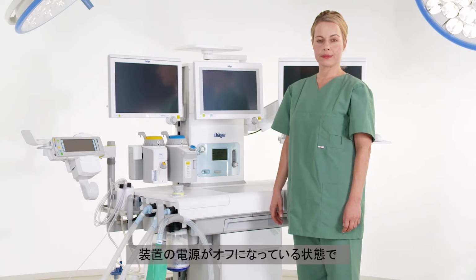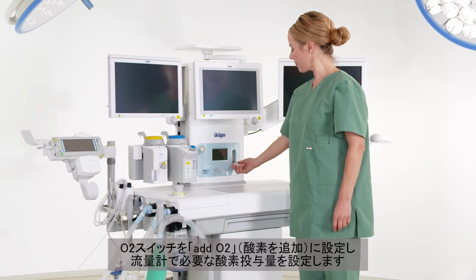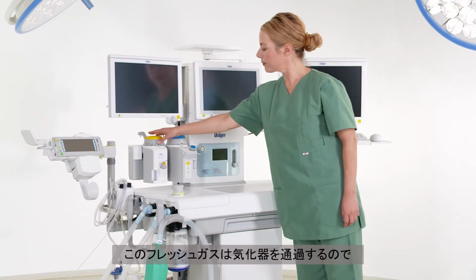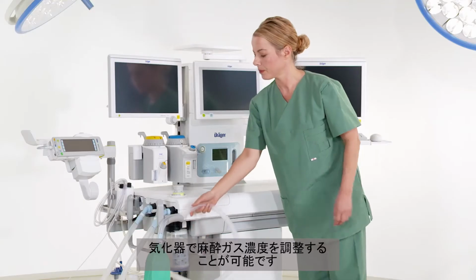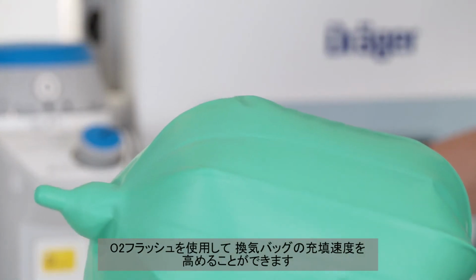While the device is still turned off, set the O2 switch to Add O2 and set the desired O2 flow dose using the flow tube. As this fresh gas flow passes through the vaporizer, you have the option to adjust the anesthetic gas concentration on the vaporizer. You can use the O2 flush to speed up the filling of the breathing bag.